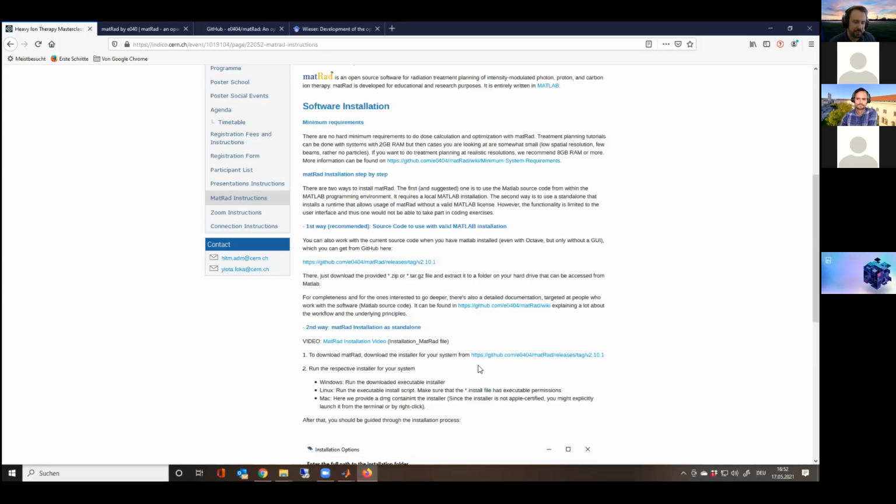So the question that Dami asked in the chat, if you have to deinstall or uninstall this version, I have to admit I am not sure, because it's a different setting. I do not think that you need to uninstall it.